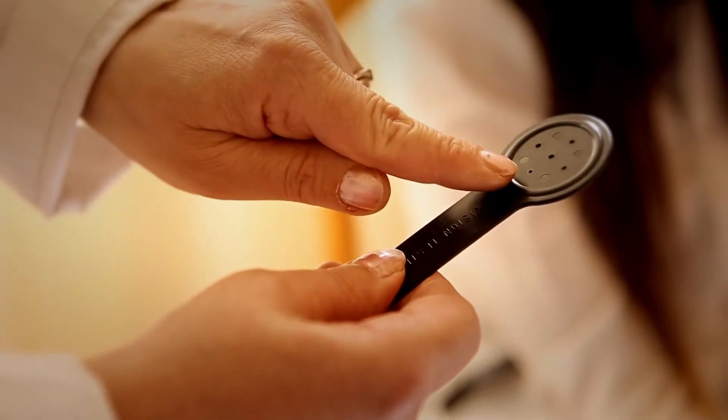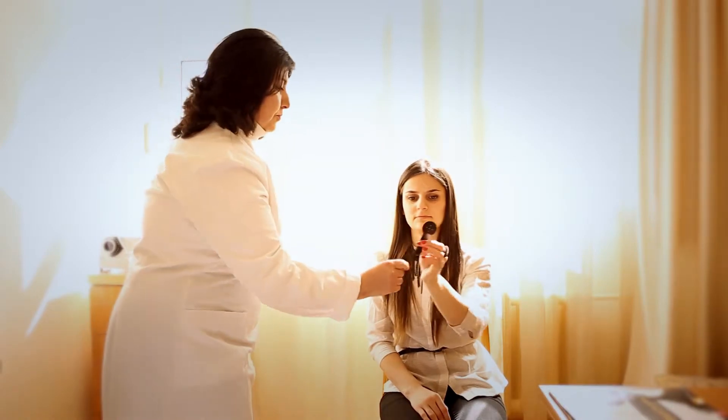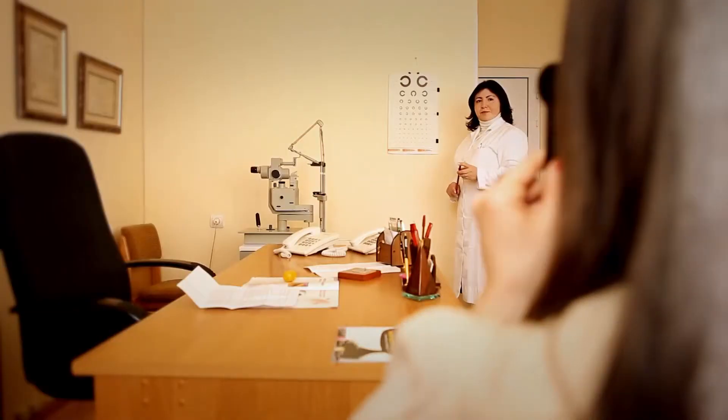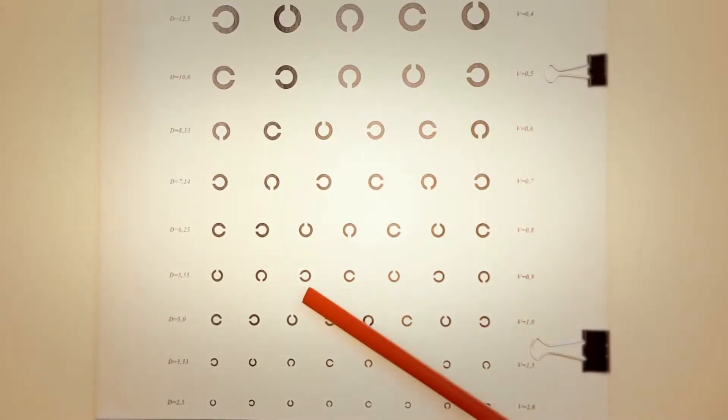Visual acuity testing is the first step of eye examination in all patients. The only exception is the patient with chemical burn, who requires urgent irrigation. Measure the visual acuity for each eye. Use a pinhole if acuity is worse than 20 over 30, equals 0.7.